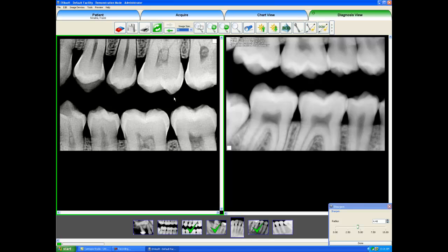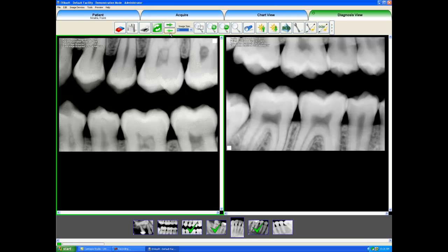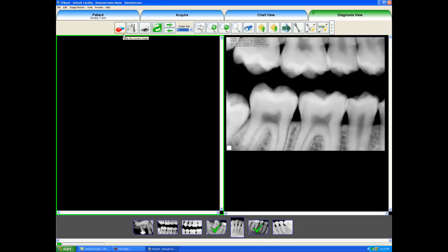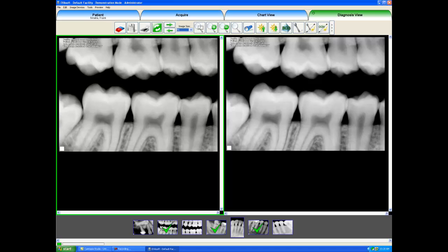Now I am making a lot of manipulations to an image; however, I am just playing with the different filters. The original image that I acquired with the Eva sensor still stays and is saved as the original image in Evasoft's database. At any point in time, I can click this button here to view the original image, or I could click the undo button just to go back a step. As I click the button, we will see that it will undo the different filters that we have selected. In Evasoft, I can also click the clear current image button in order to remove that from the active window, and simply select another image to look at.